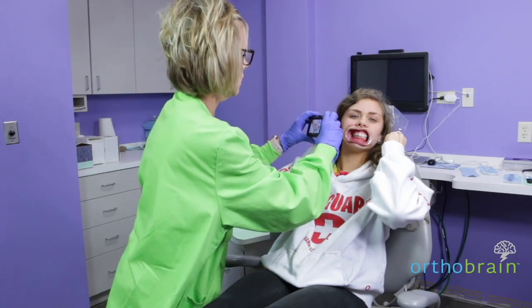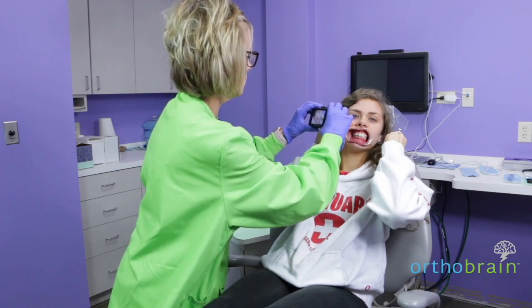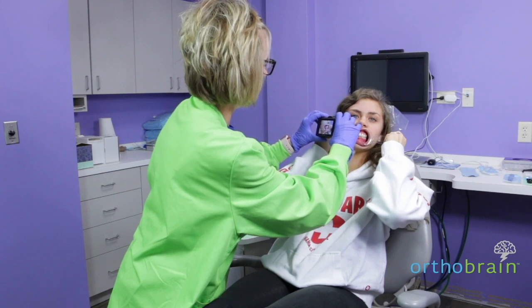You want to be straight on. You want the occlusal plane to be straight. You don't want to be up or down, and make sure that when you angle the camera, you can see half of the central and the first cusp of the first molar.